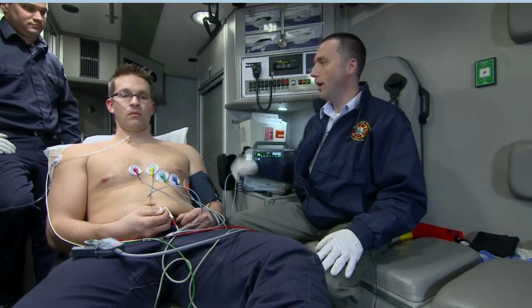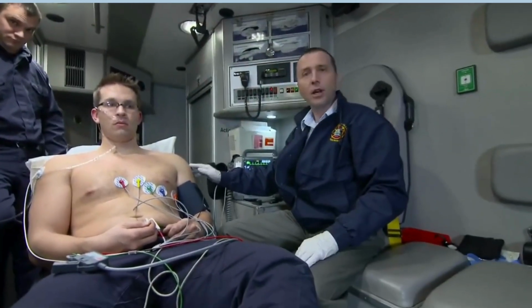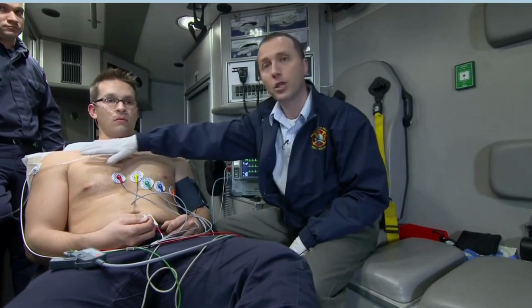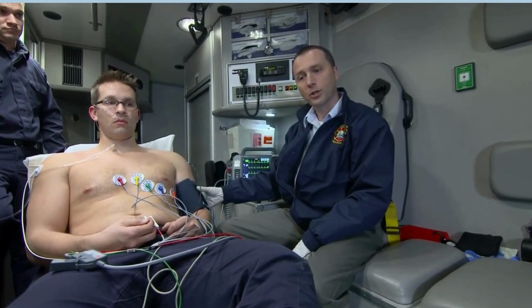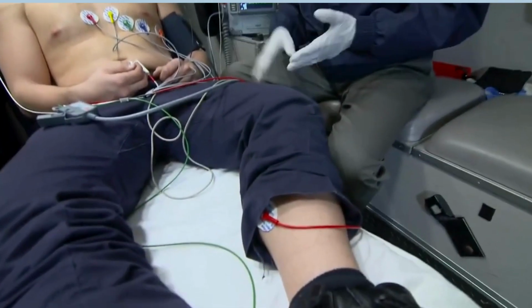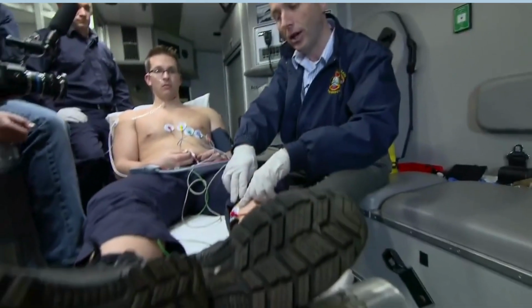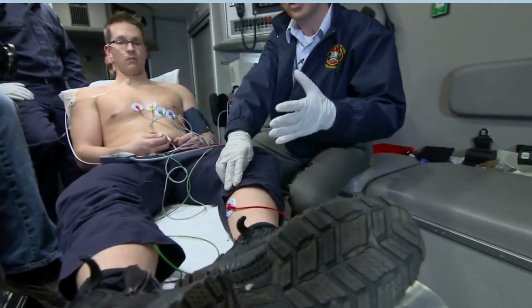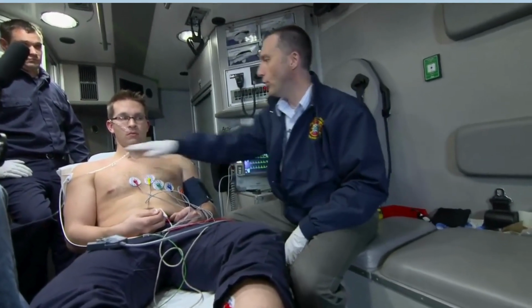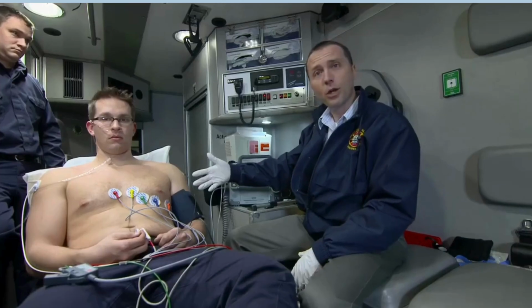First thing I do with the limb leads is I place them on the center of the muscle mass of the deltoid, which does a couple things. Number one, it actually puts them on the limbs themselves instead of up on the chest, but it also leaves room for the blood pressure cuff. And then I put the red electrode really can go anywhere. If it's summertime and they're wearing shorts, it can go up here in the muscle mass of the quad. What I've done here is I put it up on the muscle of his calf. The main thing is you want to try and find an area that's not really bony and not really hairy. So once the 4 leads are attached and you have a rhythm up on the monitor, you can go ahead and place the precordial leads.